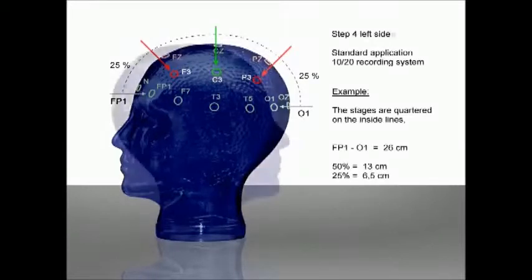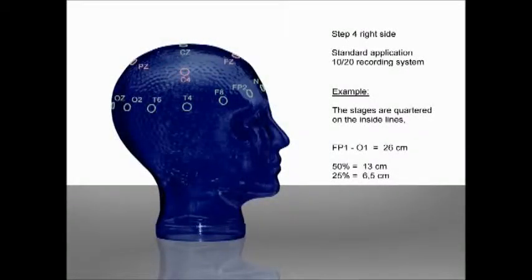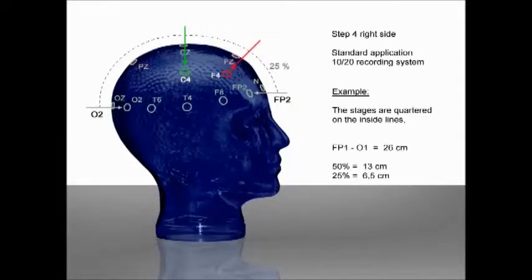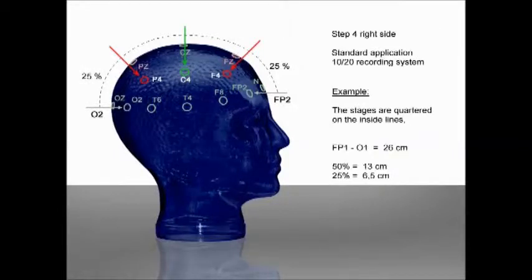We will now determine the points for the right side of the head. Measure the distance from Fp2 to O2 over the existing C4 intermediate mark — in our example also 26 cm. Make the final mark for C4 at the halfway point (13 cm). Mark F4 at one quarter of the distance (6.5 cm) from Fp2, and mark P4 at one quarter (6.5 cm) from O2.